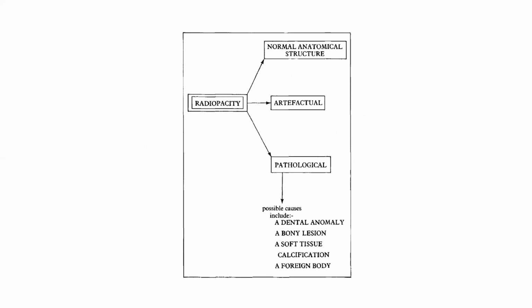So that's the opacity, if it's actually within the bone or if it's within the surrounding soft tissue and is superimposed on the bone. To localize the opacity, usually two radiographs are required, ideally at right angles to one another. Also, size, shape, outline, or periphery are addressed in the first step, as well as its relative radiodensity, effects on adjacent surrounding structures, and time present, obviously, if known.